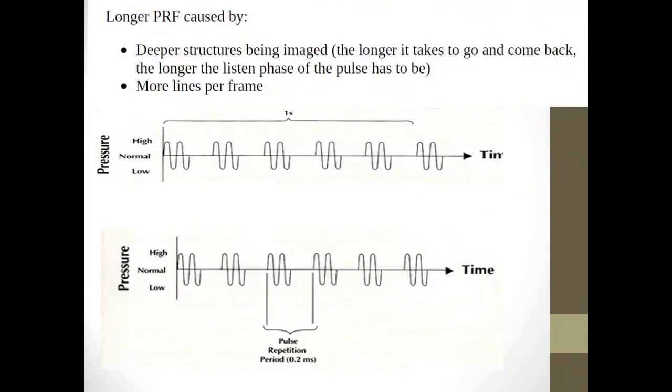Certainly, of course, each component needs a line. Not all components work at once, right? The waiting time should definitely be reduced significantly, and they must work one at a time. They really should only operate individually. We will talk about it in the process of the probe itself.